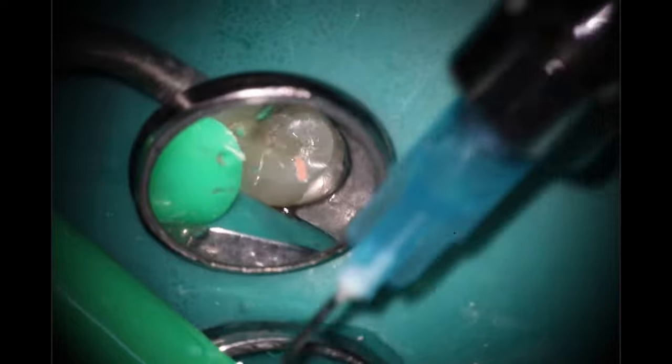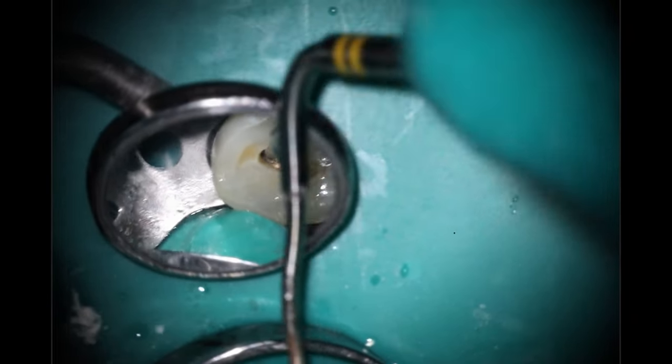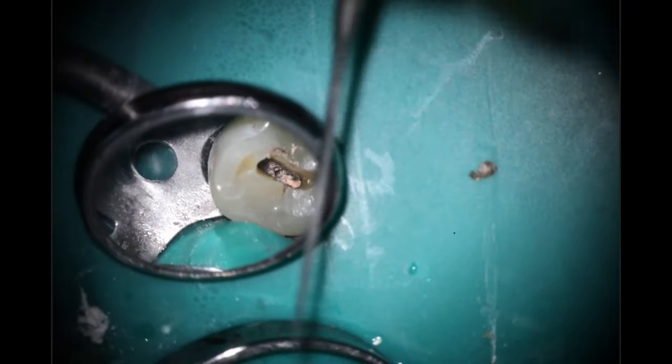Obturation is done. We're going to clean up that mess using isopropyl alcohol, scrub that off, and rinse to make sure we get it nice and clean. Then we're going to test-fit our post and take an x-ray to make sure everything looks great. Going in with that post — I usually use the B&L Alpha to create my post space here, with a nice 45-04 tip. I'm not removing any excess tooth structure, and I can control it because the size post I usually use is a 50-04 from Brassler. The 45-04 seems to be a nice fit — I was getting little voids right at the junction between the gutta percha and the post itself, and the 45 goes just slightly farther, which I think allows the composite to better encase the post.